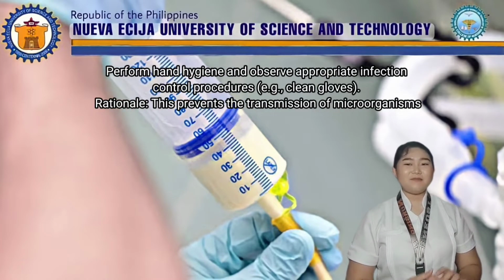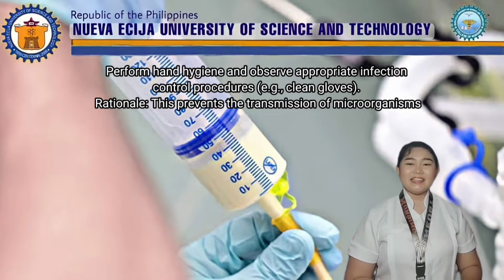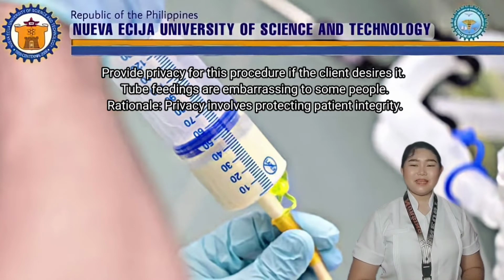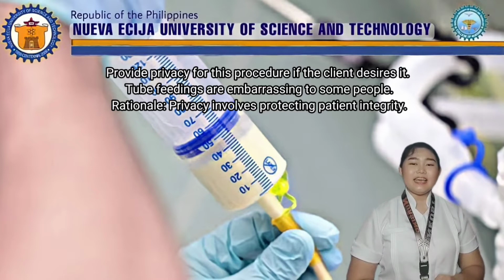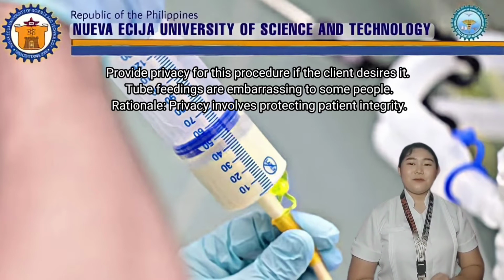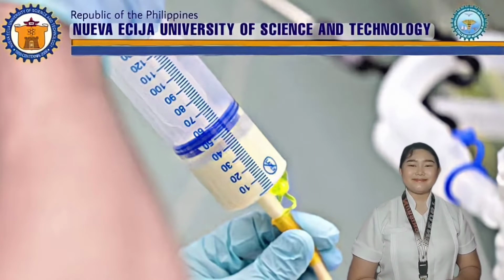Perform hand hygiene and observe appropriate infection control procedures. Rationale, this prevents the transmission of microorganisms. Provide privacy for this procedure if the client desires. Tube feedings are embarrassing to some people. Rationale, privacy involves protecting patients' integrity.